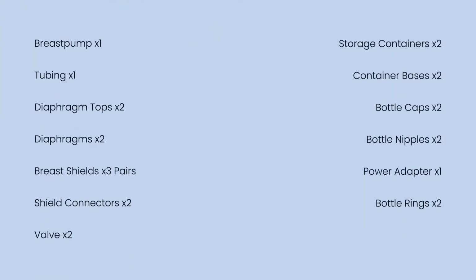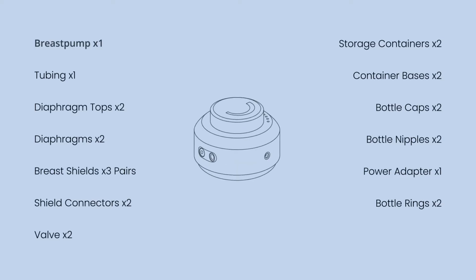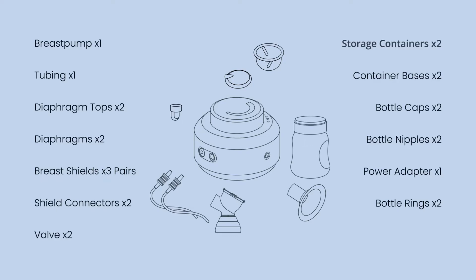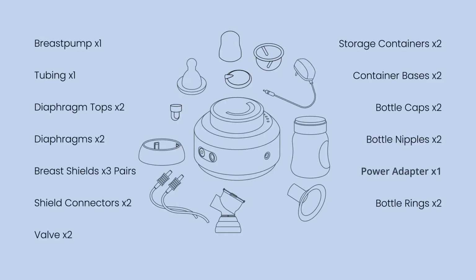When unpacking the box, make sure all of the following components are enclosed: 1 Motif Twist breast pump, 1 set of tubing, 2 diaphragm tops and diaphragms, 1 pair of each of the following breast shield sizes: 24mm, 28mm, and 32mm, 2 breast shield connectors, 2 valves, 2 storage containers, 2 storage container bases, 2 bottle caps and bottle nipples, 1 power adapter, 2 bottle rings.